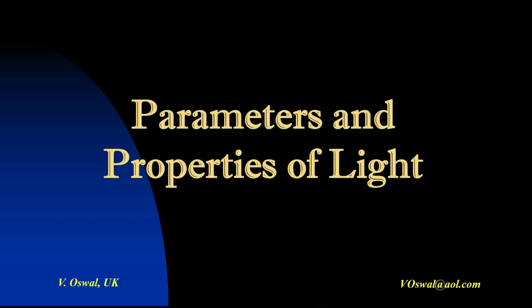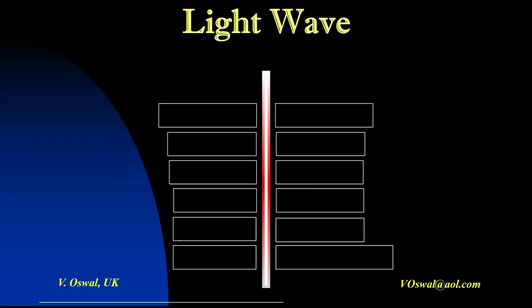Let's define some common terms used to express the various parameters of laser light. However, it's important to note that in isolation, they mean very little to understand the laser action on tissue. The eventual tissue effect depends on how a particular tissue interacts with the laser energy, as described later.